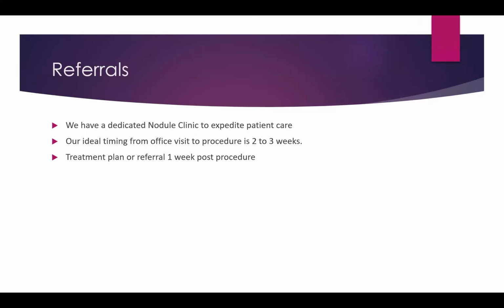Thank you so much. This one looks like it is our last question. Dr. Geiser, could you go through how long the actual procedure takes? Yeah, so usually we do those procedures in our endoscopy area. So typically patients come about an hour prior to their procedure. That's where you get registered by the nurse. They take your vitals. You'll meet anesthesia. They'll go over what that general anesthetic looks like, make sure that you don't have any questions, go over your history of any problems with anesthesia in the past to make sure that we're keeping you safe during the procedure.